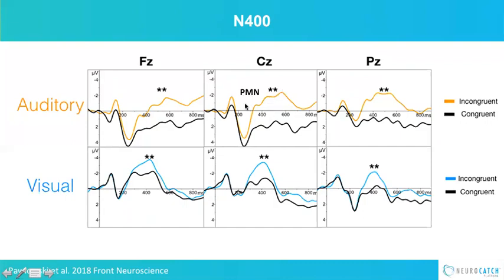And there's a lot of research that has unpacked this to understand how our brains process language, and they're highly reliable characteristic features. But the important part for this module is to let your inner experimentalist compare when I hear speech to when I see an instantaneous image of a word. And look at the shape of the peak for the N400.